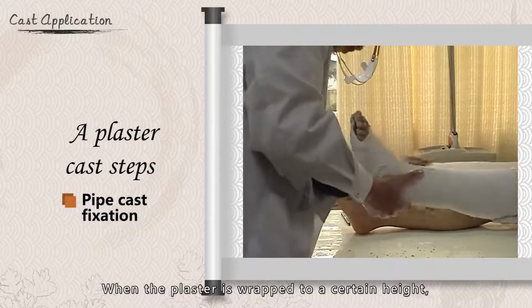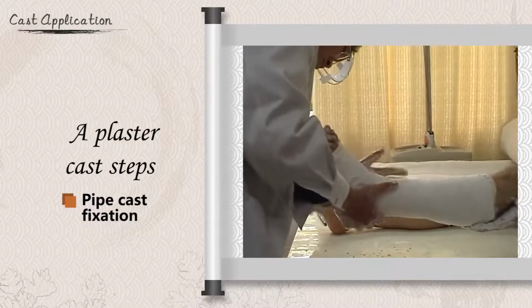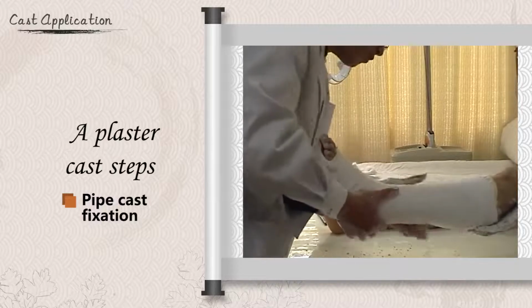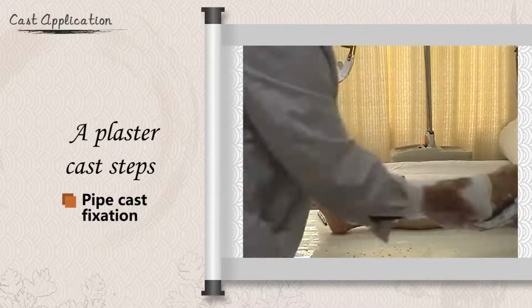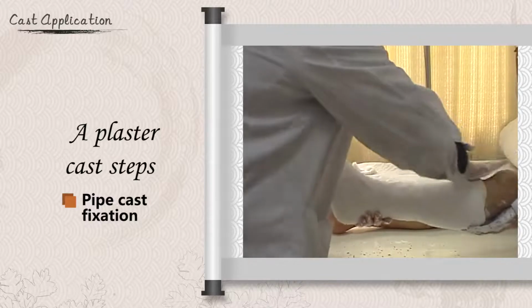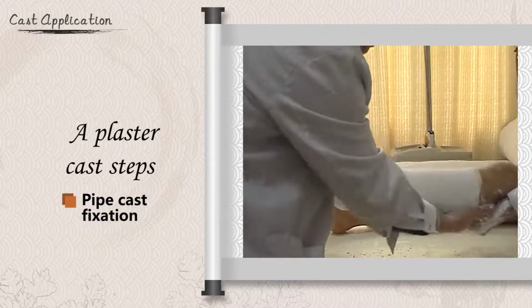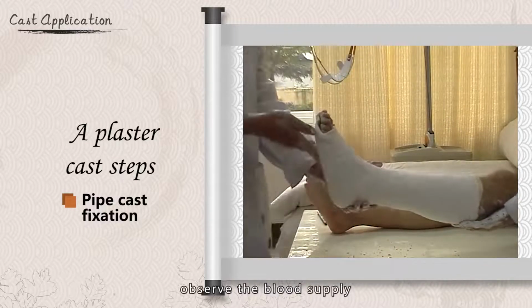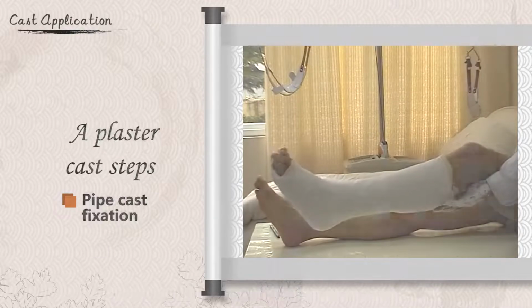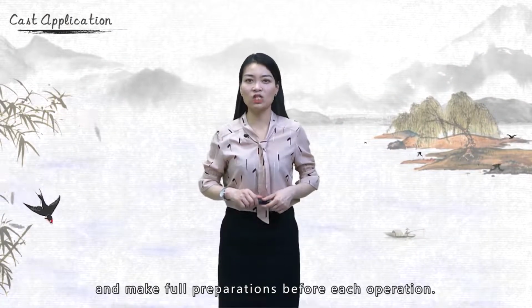When the plaster is wrapped to a certain height, press the plaster with the palm. After fixation, observe the blood supply and activity of the distal end of the affected limb. Operate step by step and make full preparation before each operation.